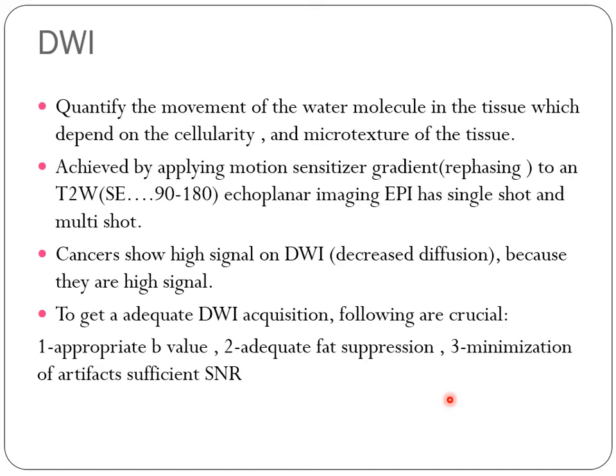As I told you before, this is a very complex physical topic. It's mainly storing the data from the whole excited tissue in what's called K-space. That's the space in the computer for storing the different signal strengths. So echoplanar imaging is a way to make this happen fast, let's say. There are different types, single shot and multi-shot. Each one has its own advantage and disadvantage.